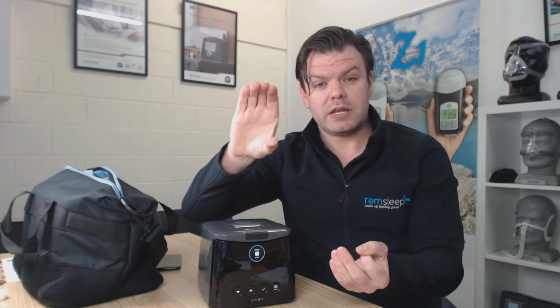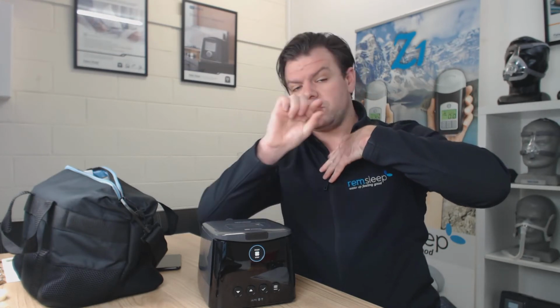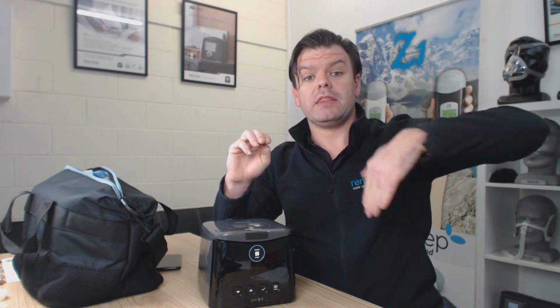Let's just do a quick example. Say your machine's on 10 centimeters of water pressure on the inhale. If you've got an expiratory relief setting of 3, it's going to drop that by 3 when you breathe out. So instead of breathing out against 10 centimeters, you're breathing out against 7 centimeters. That's a 30% reduction in the pressure as you breathe out. It's very handy for some people, because a lot of people really struggle to breathe out against the pressure coming into their airways.